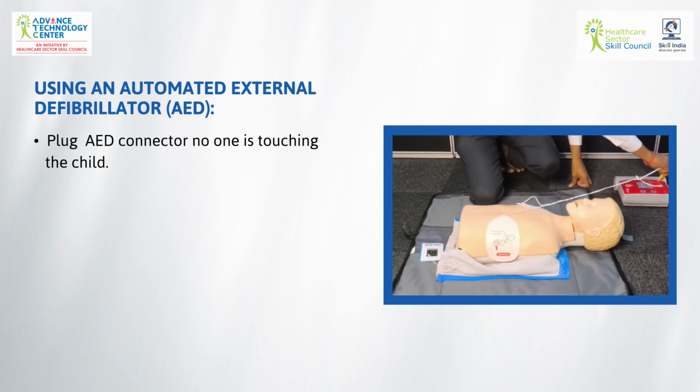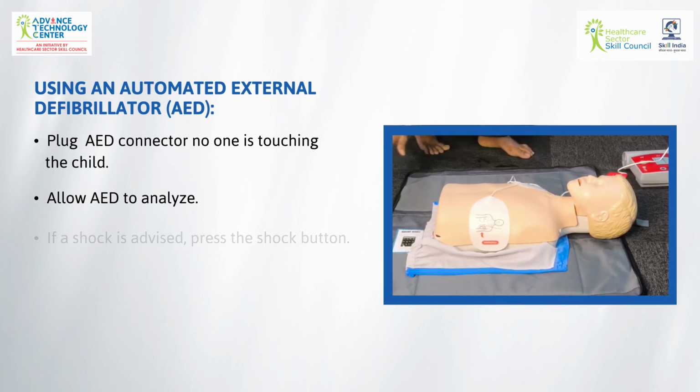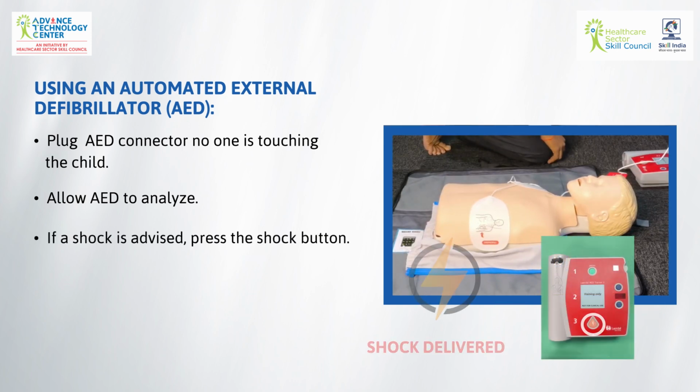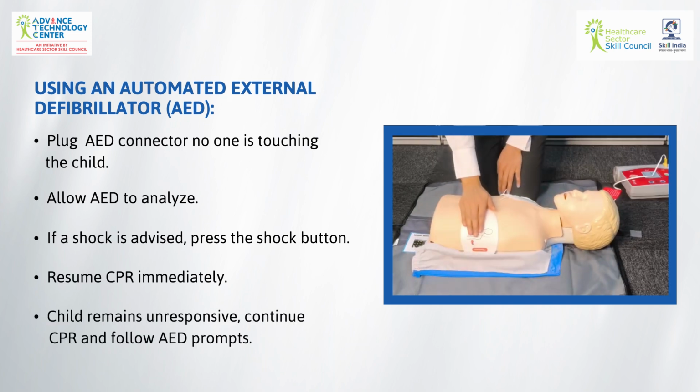Plug in the AED connector and ensure no one is touching the child. Allow AED to analyze the heart rhythm. If a shock is advised, press the shock button. Resume CPR immediately after delivering the shock. If the child remains unresponsive, continue CPR and follow AED prompts.